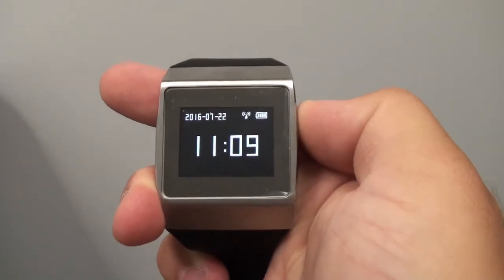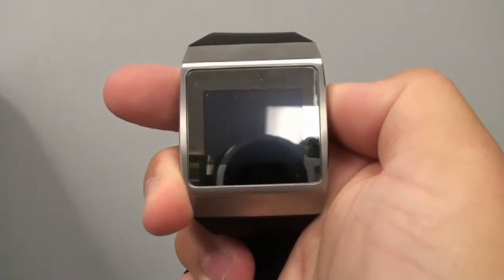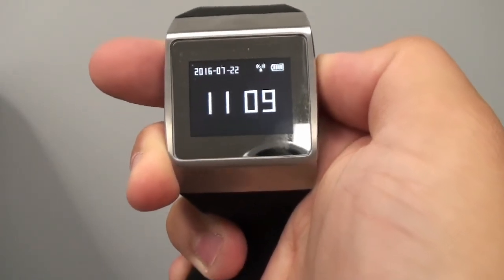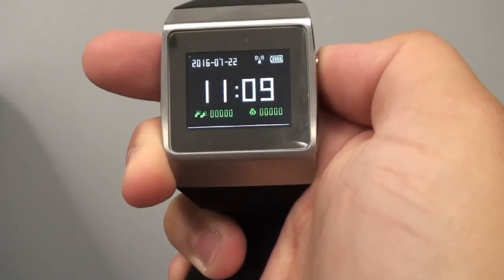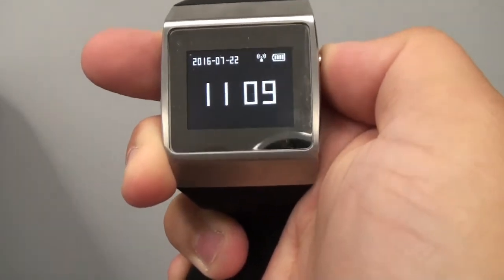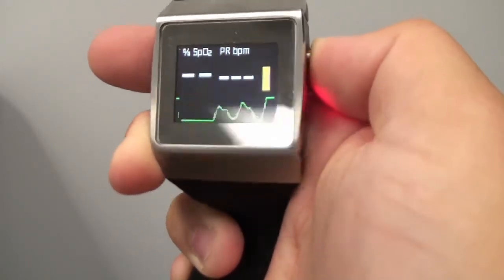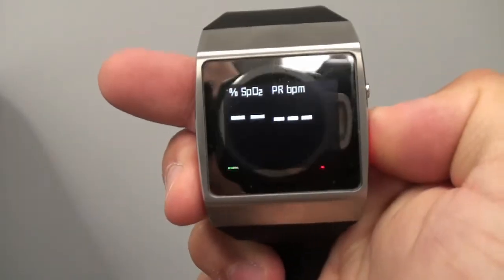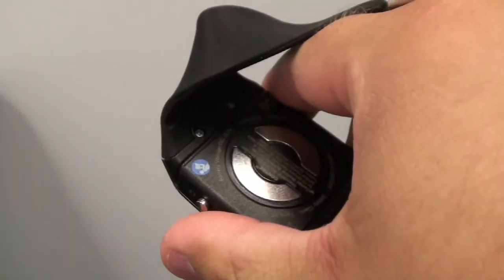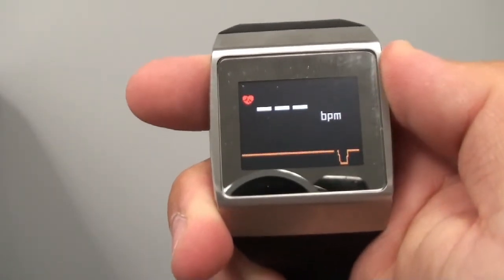The device itself is fairly easy to use. To turn it on, press and hold the silver button on the side. This will bring up the time and date, and by pressing and holding the silver button again you'll be able to bring up your footsteps. Clicking it again lets you check your blood oxygen level and pulse rate using the red sensor on the side. The sensor on the back of the device also lets you check your blood pressure.